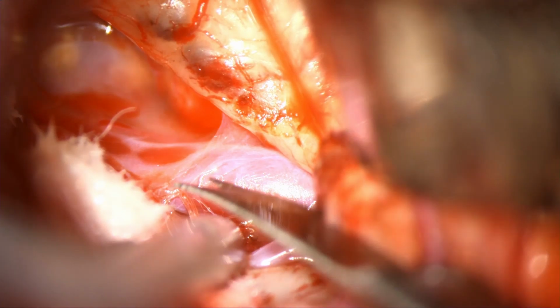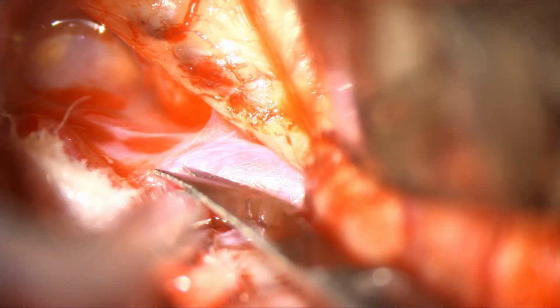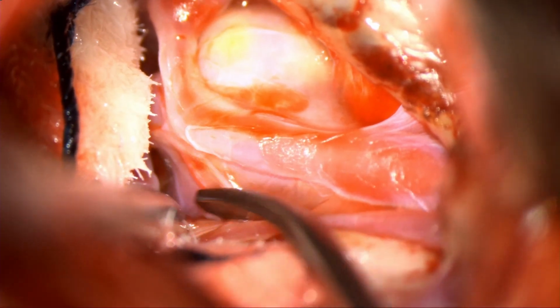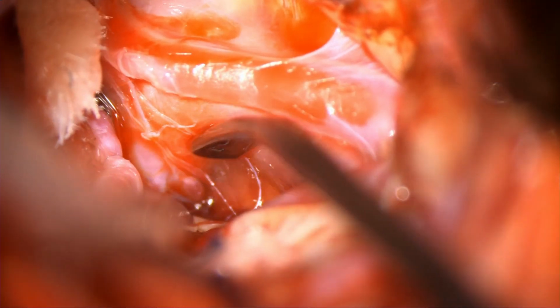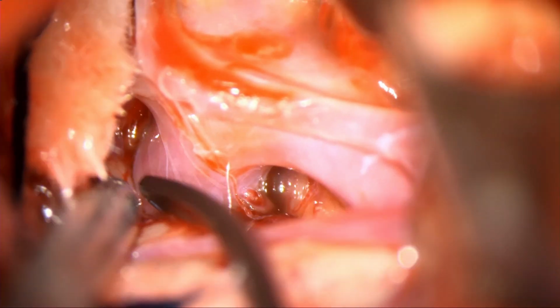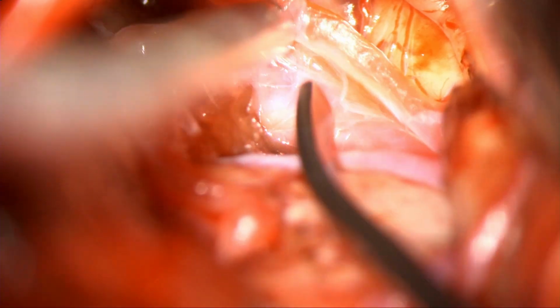We then focus our attention back to the aneurysm complex and start dissecting through the tough arachnoidal bands and tissue. The branches are carefully separated from each other. The smaller frontal branch is already spasming and kinking. Here is the proximal M2 just before the bifurcation. Now we have a good landing zone for a clip, temporary clip if needed.